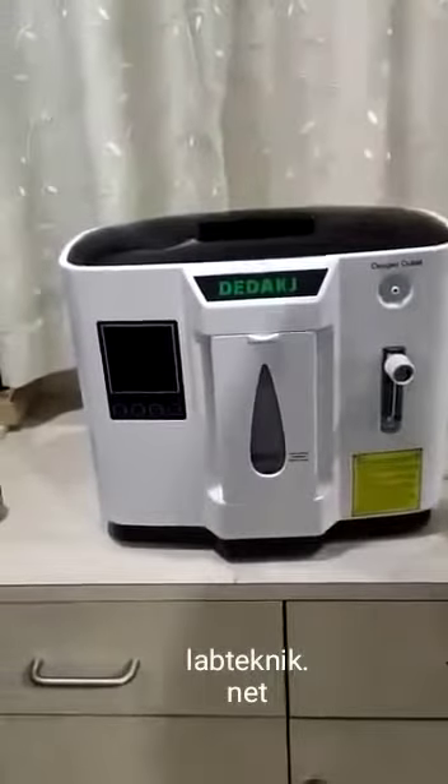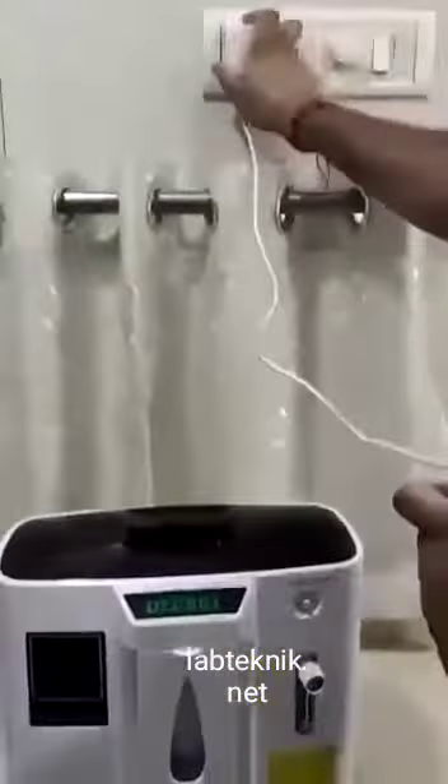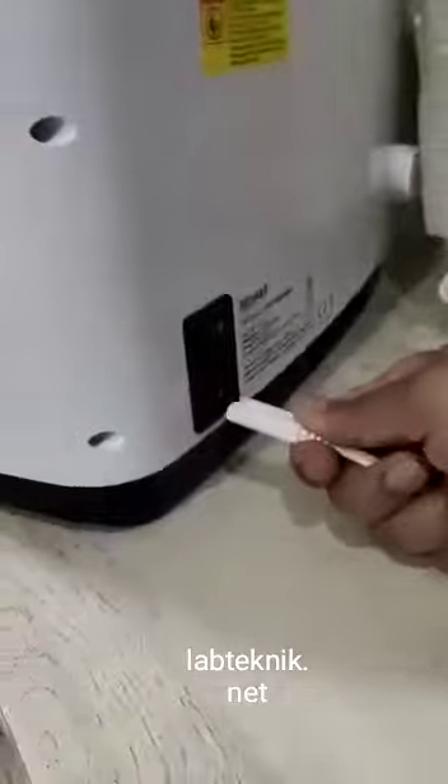Then the next thing you need to do is the cable — take it off. At the back you can see there is a socket. You need to insert this and switch on the plug.